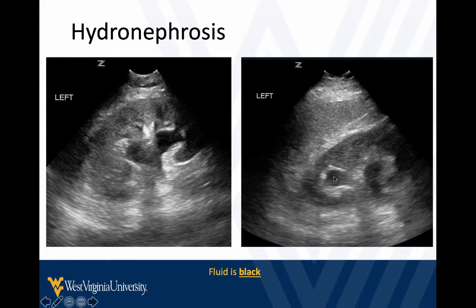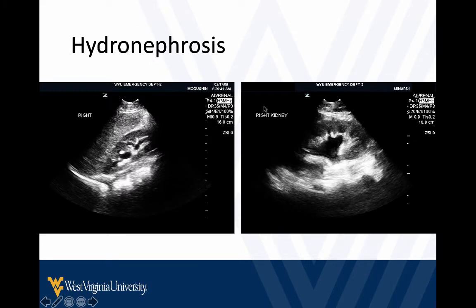Remember, we fan through the kidneys completely — we don't just take a single picture. The fluid is black. These are both cases of probably mild hydronephrosis. We see fluid dilating the collecting system — it's within the collecting system and dilating it. We can see the other landmarks look pretty good. Sometimes this is called the bear claw sign in the kidney where it's dilated. Hydronephrosis is relatively straightforward as long as you get a decent image and fan through it completely.